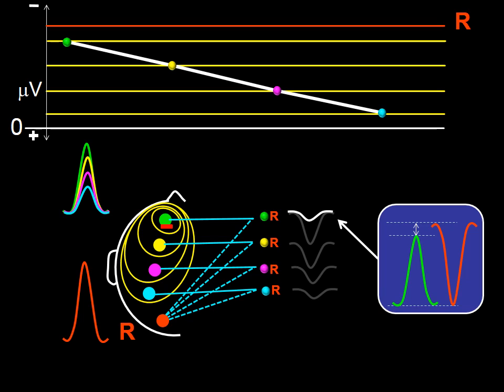By doing the same operation as we have done previously, you can see that the resulting wave from the first derivation is smaller than the one in question from the same derivation, and that the following waves using the same process are bigger and not smaller as the ones in question.